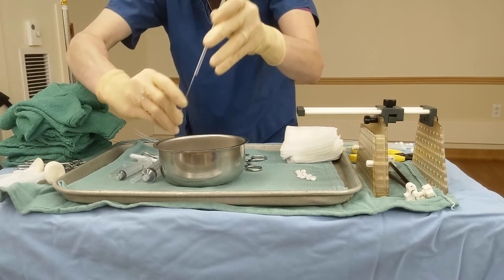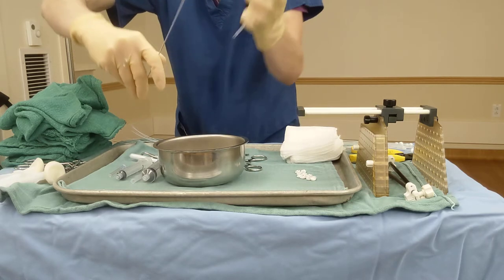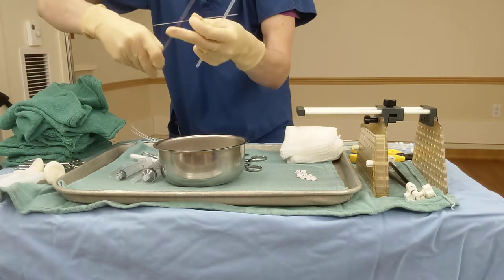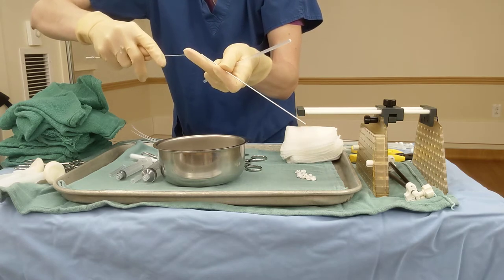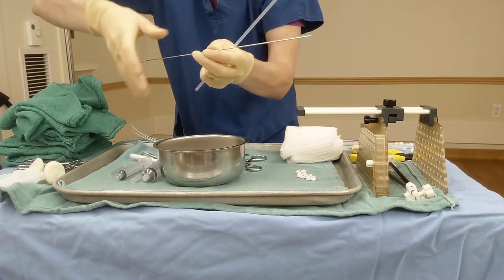When you take the sheath off, you have to be very careful that the little metal tube does not come out of the needle and drop on the floor, because that will be very counterproductive to the procedure itself. And if it comes out, it's hard to get back in.